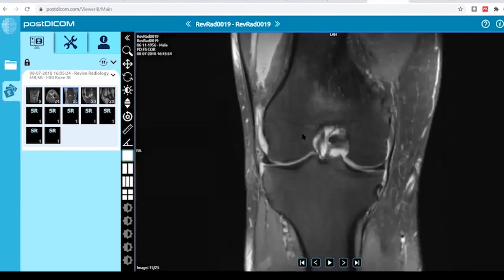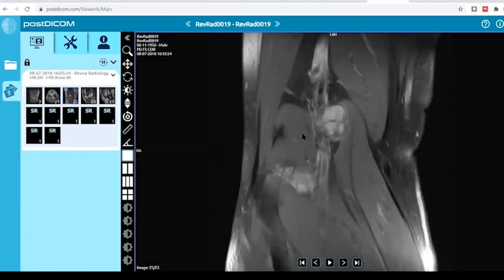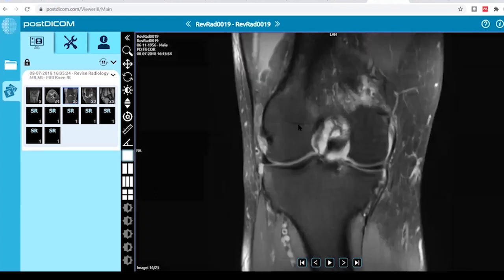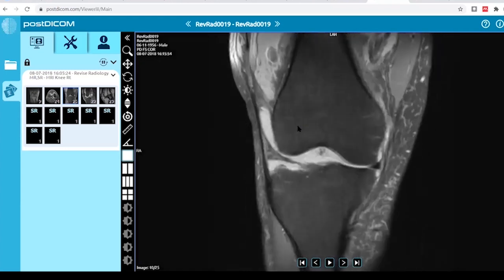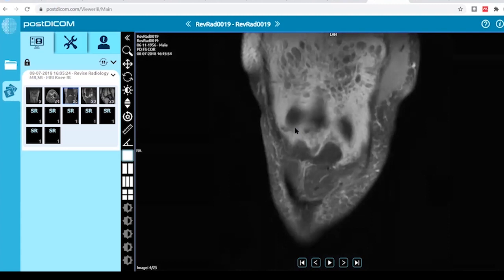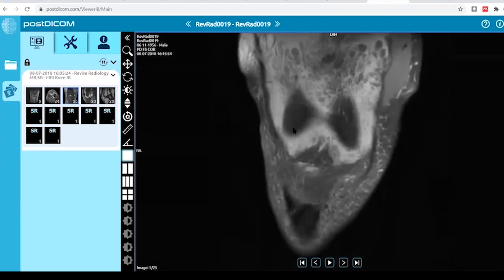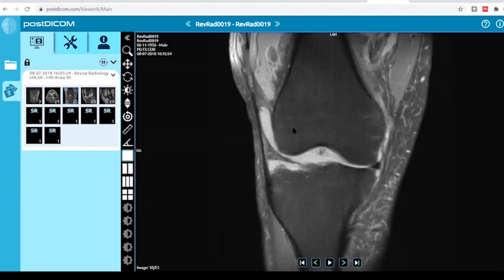In the coronal view, I can confirm that there is a multi-loculated joint effusion seen, mostly involving the suprapatellar pouch.